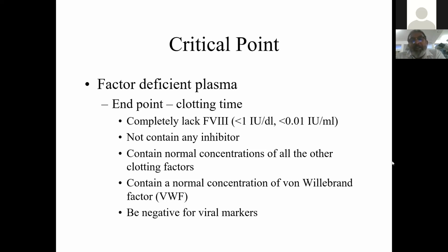So it should completely lack factor VIII. It should not contain any inhibitors. It should contain normal concentration of all the other coagulation factors, especially fibrinogen. Ideally, it should contain normal concentration of von Willebrand's factor and be negative for viral markers.